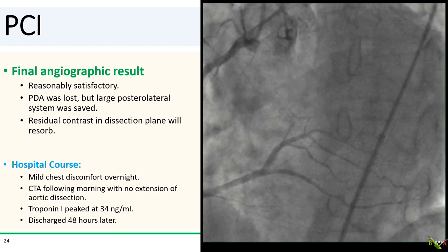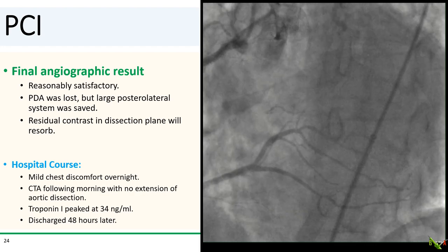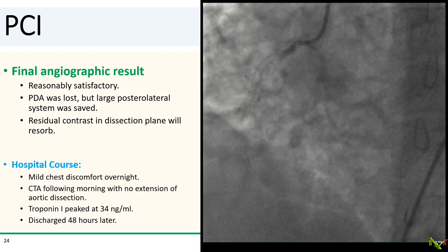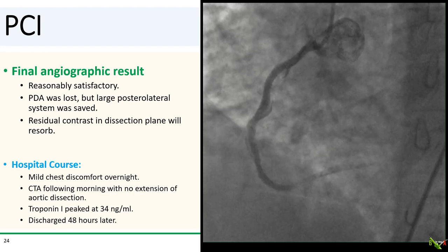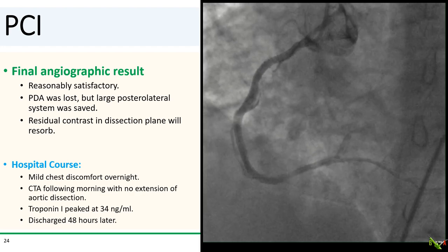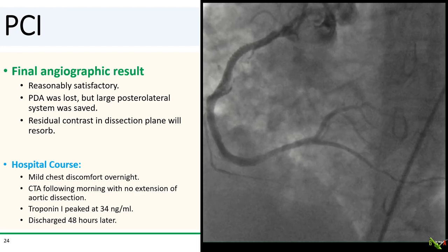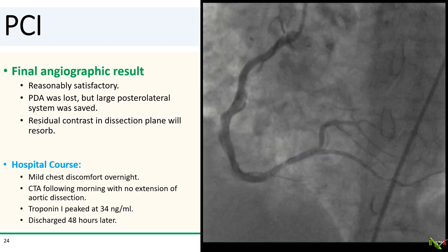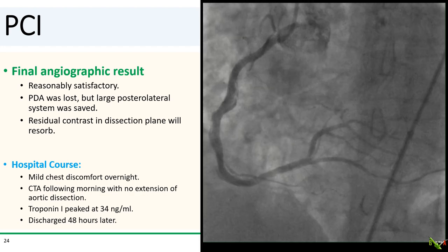Here is the final angiographic result, which is reasonably satisfactory. The PDA was lost, but we were able to save the large posterolateral system. The contrast in the false lumen will eventually resorb. The patient did reasonably well — she had mild chest pain overnight that resolved by the next morning. We did a CTA, which thankfully showed no extension of the aortic dissection. Her troponin peaked at 34 nanograms per mil, and she was discharged home 48 hours later.